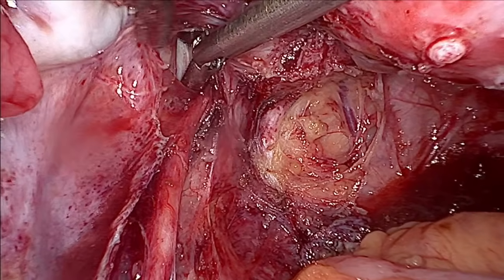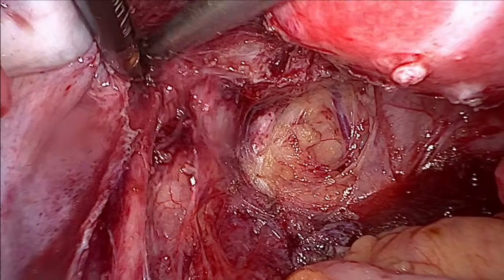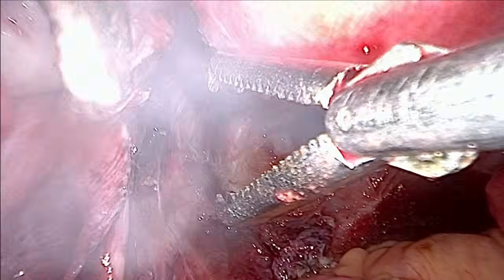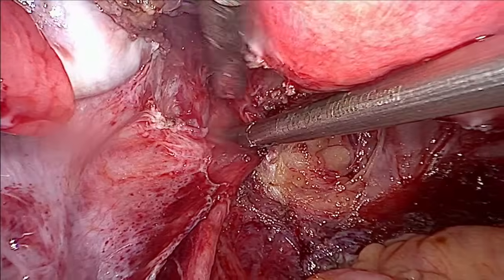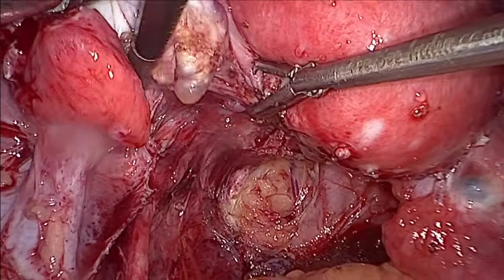Yes. Okay, we have created a plane here. Okay, so the ureter is going down. Okay, and we can just safely cut here. Okay, so now there is this free space. Okay, this is the uterine here.